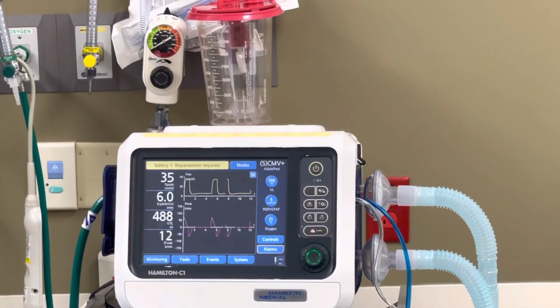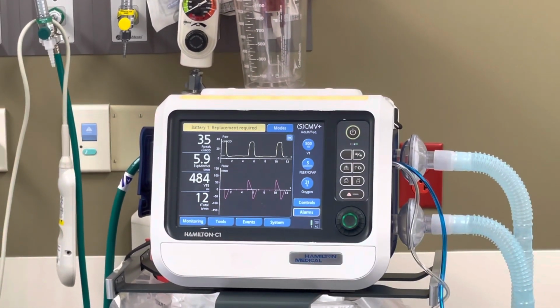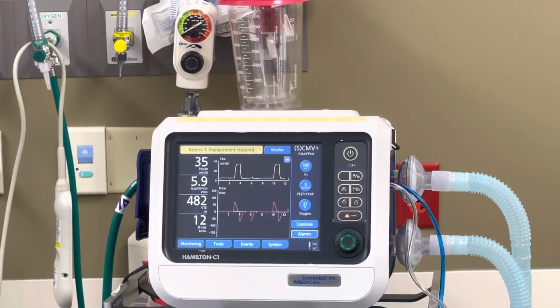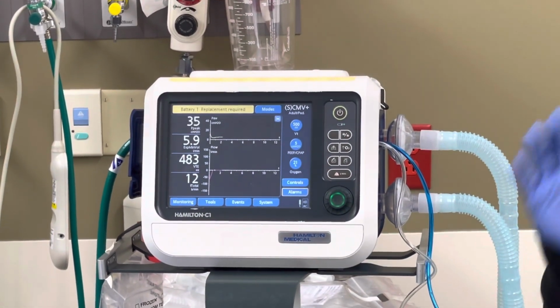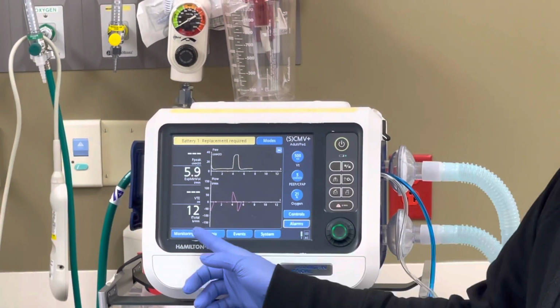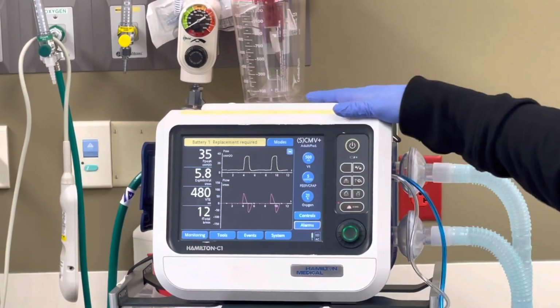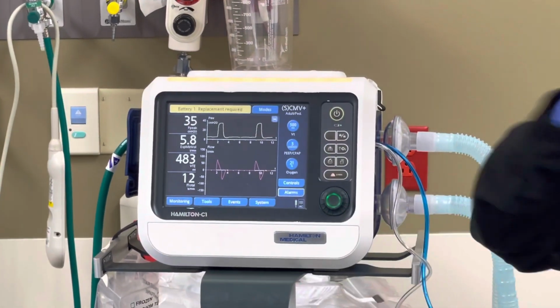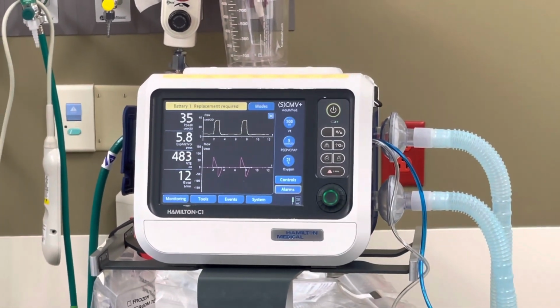No? Okay. So whenever your vent is running, this is what you're gonna see on the patient. So right now, my patient is not breathing over, so every breath is going to be a mandatory breath. So this patient is breathing 12 breaths, 500 tidal volume approximately every single time. Okay. And then you're gonna see that it will recalculate itself, and you'll see things kind of dash out. It's because the vent itself is recycling and kind of adjusting itself.